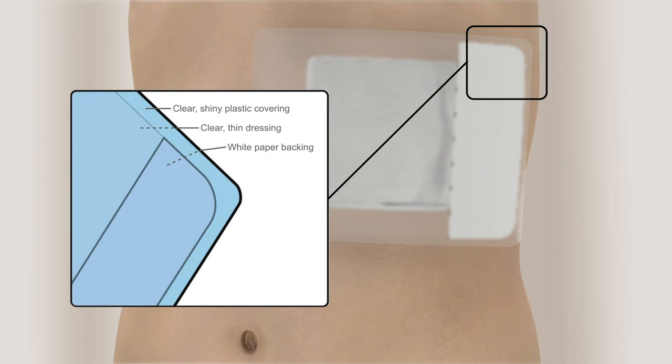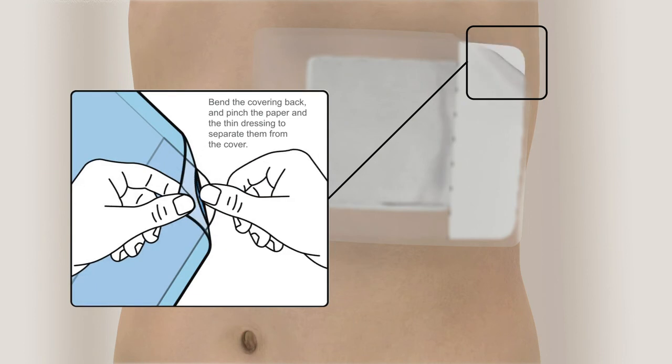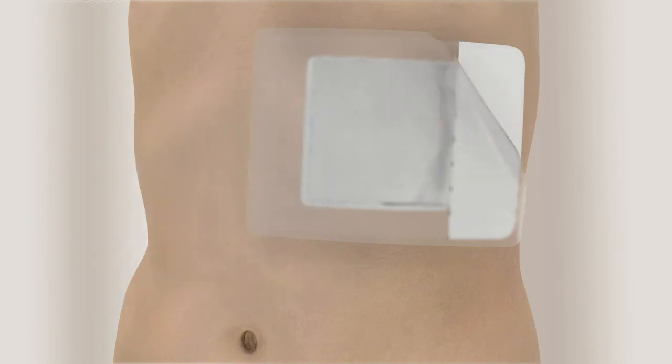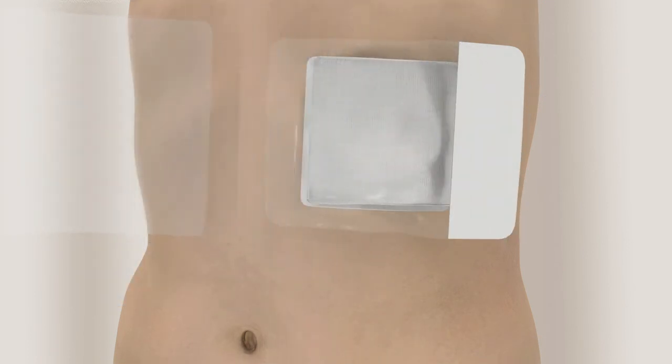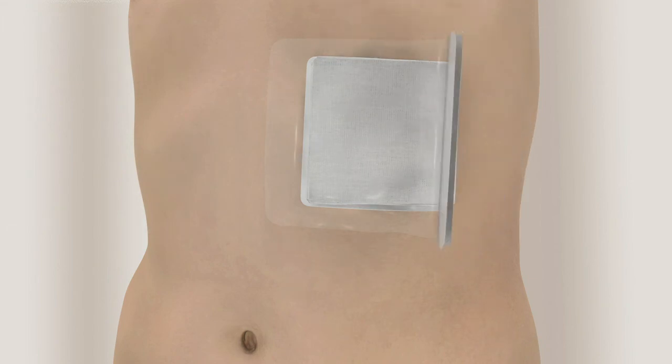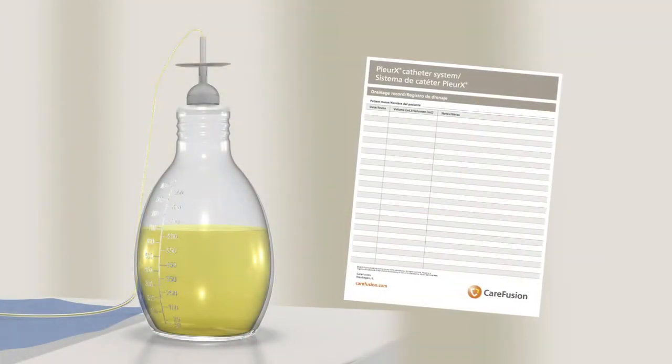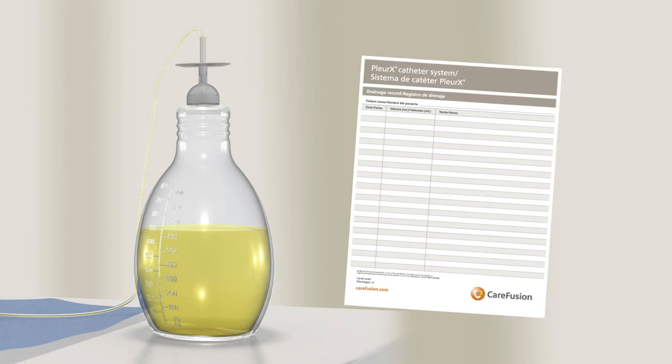Remove the thicker, shiny plastic covering from the adhesive dressing by starting at one of the paper backing's corners. Bend the covering back, and pinch the paper and the thin dressing to separate them from the cover. The thin dressing should remain attached to the paper backing during this step. Next, peel off the thicker plastic covering. Finally, remove the remaining paper and press the dressing down. Record the volume, color, and appearance of fluid drained on the drainage chart.